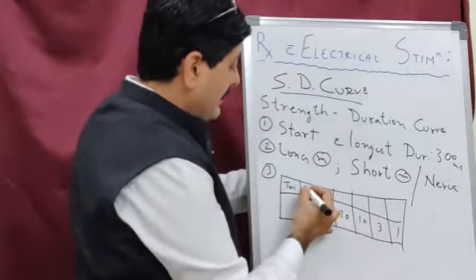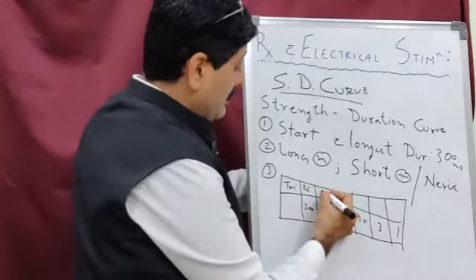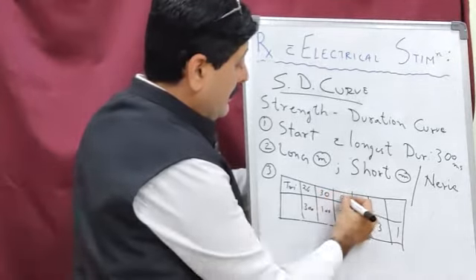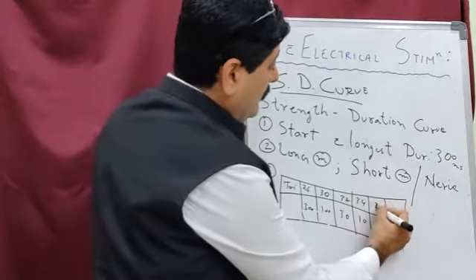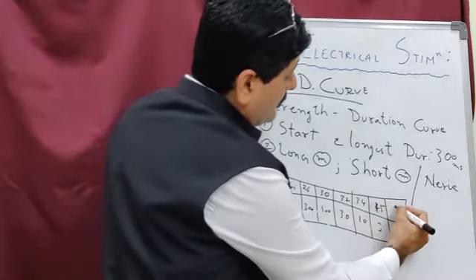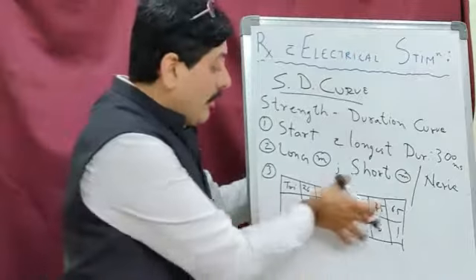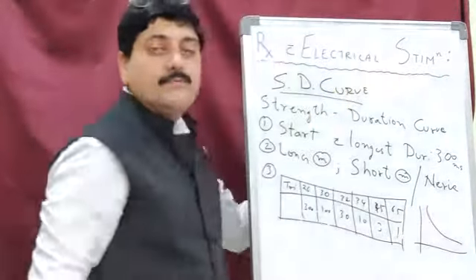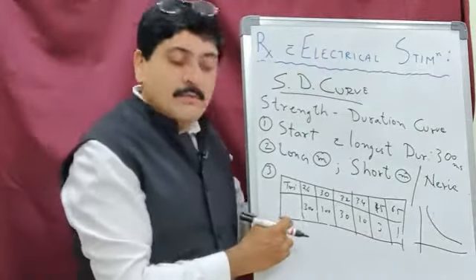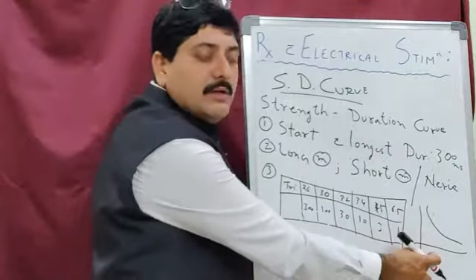And here we will write the intensities: 26 or it can be 30 or 32 or 34 or 45 or 65, right? So you have to make a tabulated form and then put it in the chart form. Okay, so you will measure the data, keep this in record, and then you will go for the chart form.